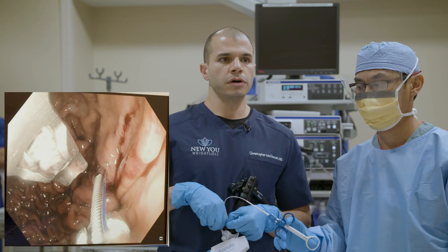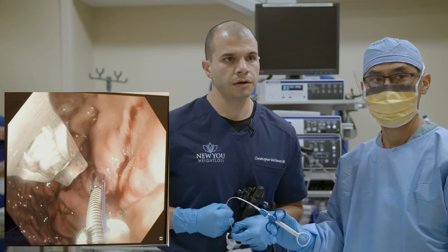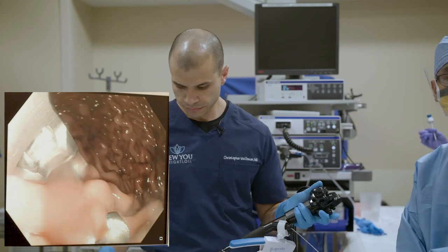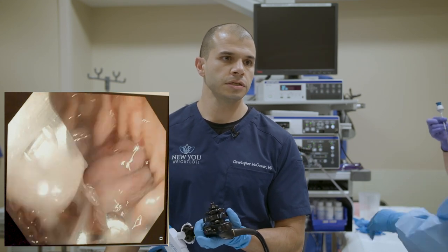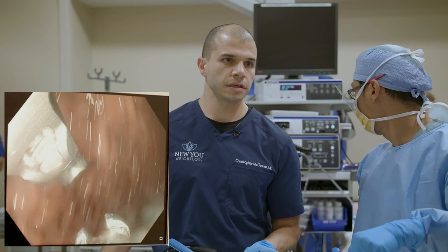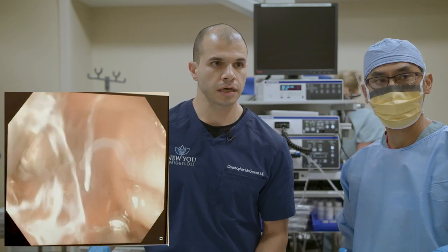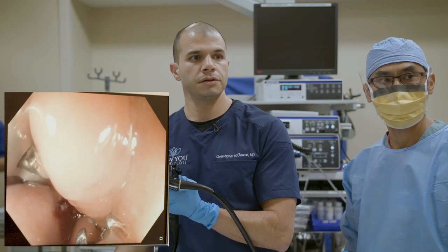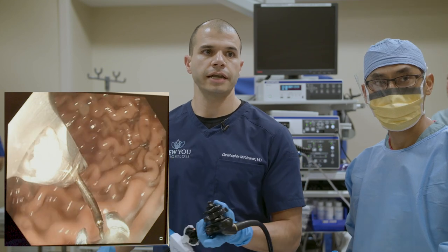I'm drawing in the suture and tightening it — you can see it all gathering together. I want this to be tight, but not too tight. Roche is cinching it now. That suture is locked in place. That's our first suture. There's always a little bit of blood during this procedure, which is normal and a sign of a good, healthy stomach with a nice, rich blood supply. If anyone has a sensitive stomach, just be aware we do see blood during this procedure.